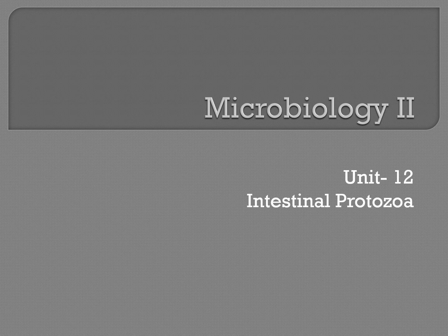Hey gang, and welcome to Unit 12, the intestinal protozoans. Be prepared to identify protozoans from cyst and troph images. Make sure you're referring to your laboratory diagrams and your textbook. Okay, so here we go.